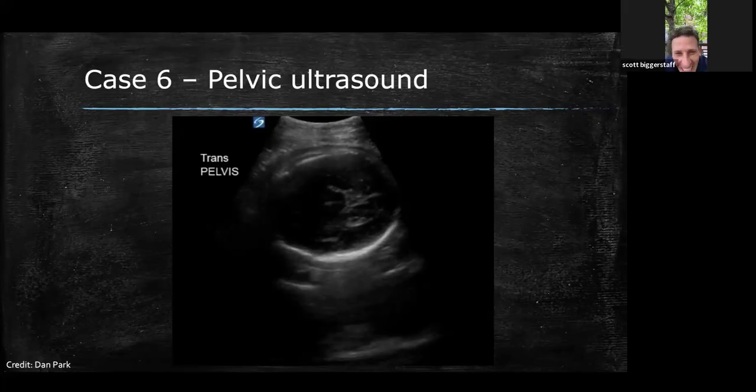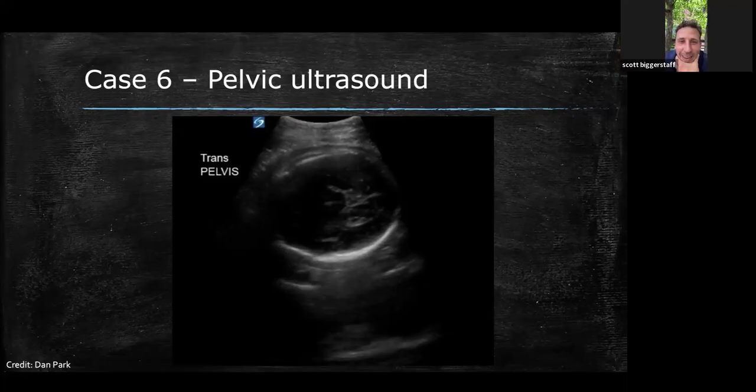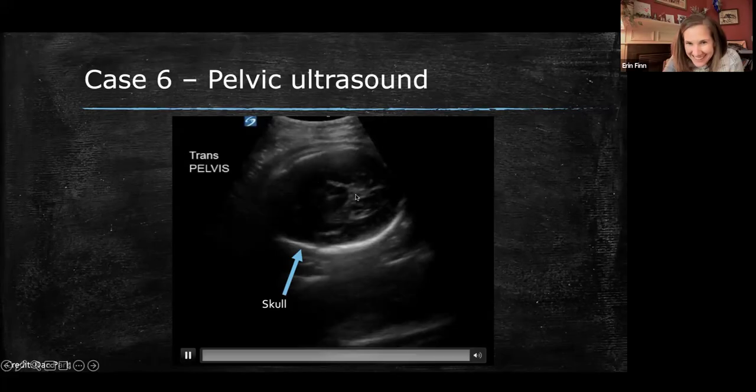Oh, I just read Ria's comment. I feel like that gave it away. Yeah, it said it's a mass of a sort. So I wonder if maybe I'm looking at the calvarium, and it's not posterior acoustic enhancement, it's actually a skull bone from a baby. Yup, you got it. And this is the brain. You guys see the child.